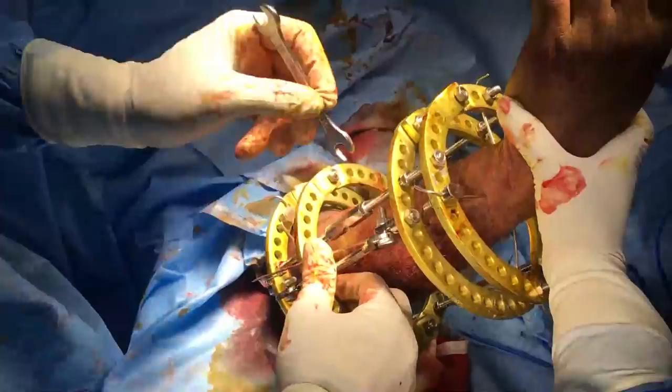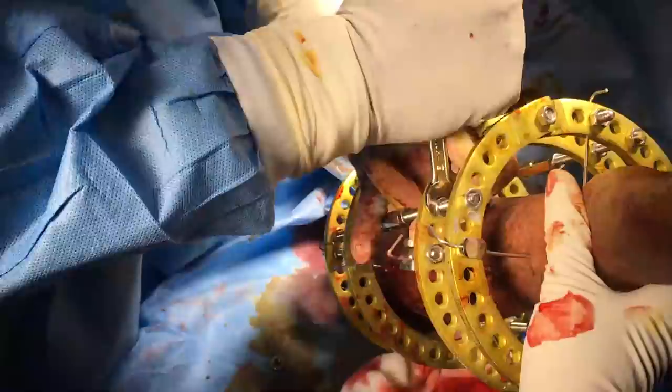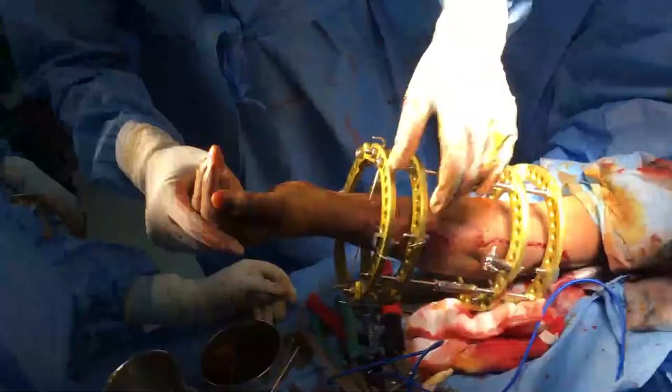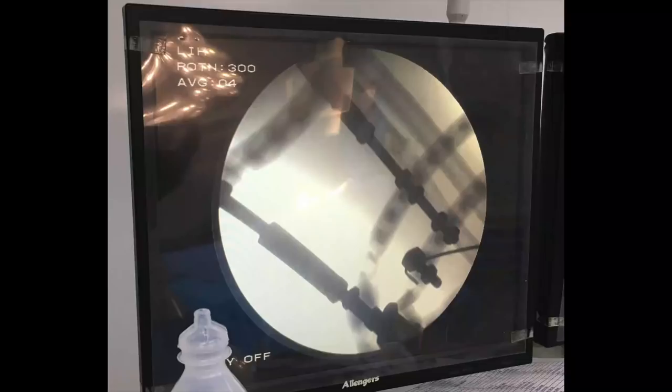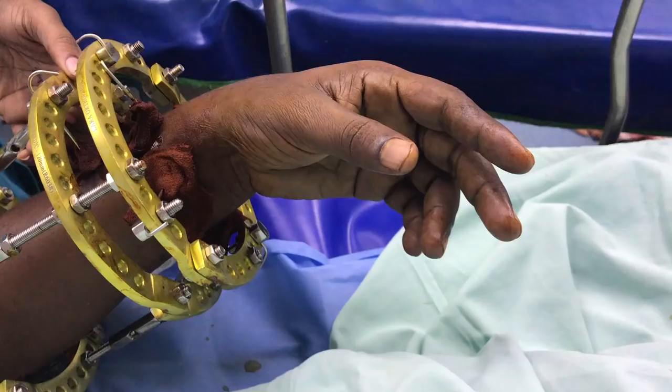Badly positioned wires pulled in the wrong direction will produce acutely painful frames. On the contrary, properly tensioned wires will produce a relatively painless frame. Here we can see the reduction is almost near-anatomic and compressed like a bone plate.